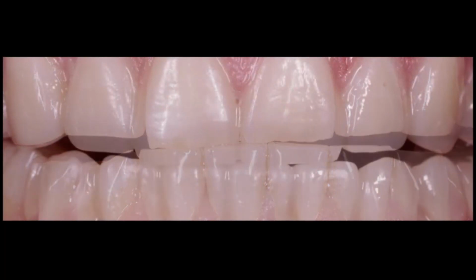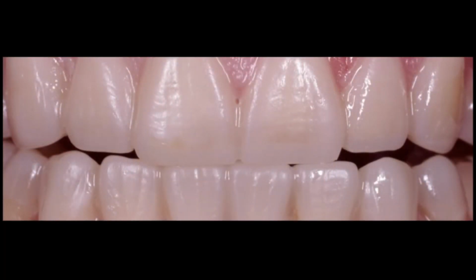So this was done in 2008. This is one of our complex cases in one of our studies. And you see Oliver did a nice work. He did a very nice wax-up. We can even check our dynamic occlusion by the mock-up. This is very important. We are using flowable composite for doing that.